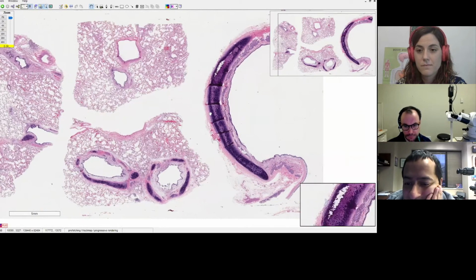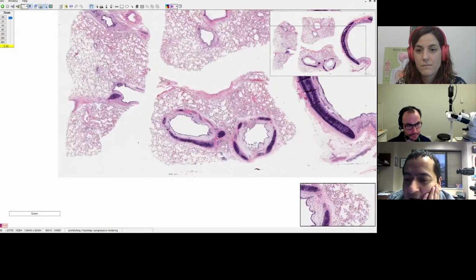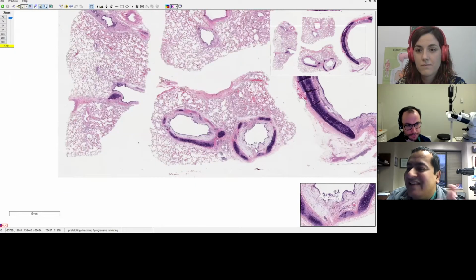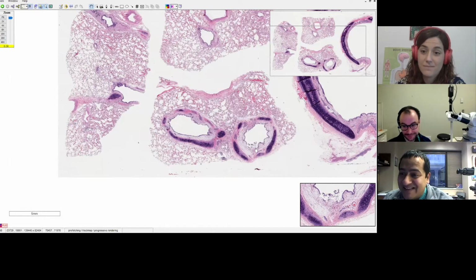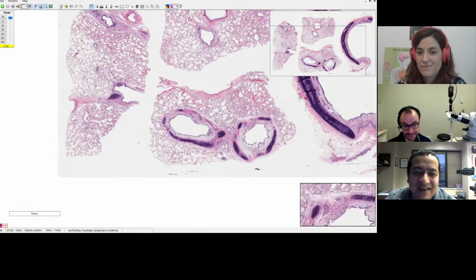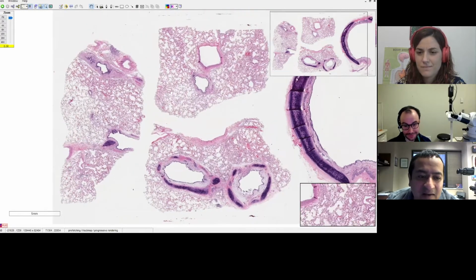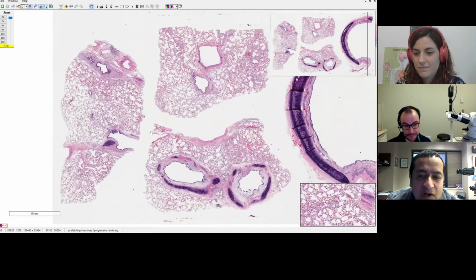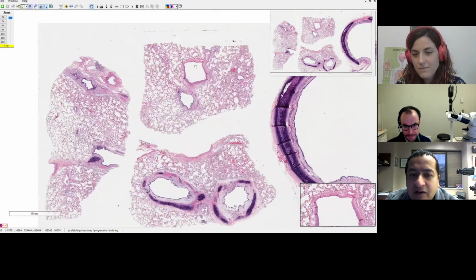And so this is a piece of bronchus, obviously. You've got a lung with two beautiful bronchi in there. So, see the difference from surgical lung biopsies? In a surgical lung biopsy, because you're peripheral, you won't get a bronchus in the section. But at autopsy, you can section those central areas. So the autopsy is really the only place where you get a bronchus within lung tissue like that. Of course, there's a bronchus in almost every section. And then here you have a bronchiole with an artery, a pulmonary artery branch. So you have a bronchovascular bundle.